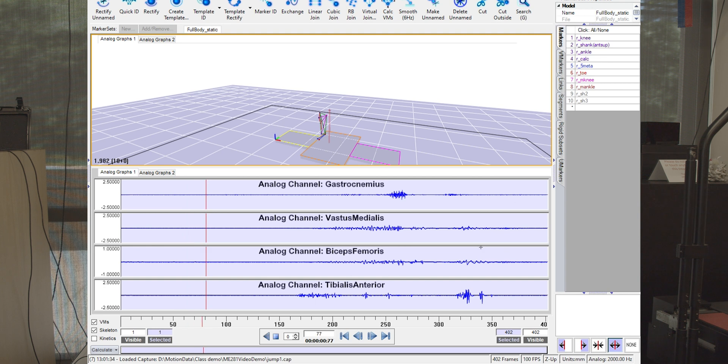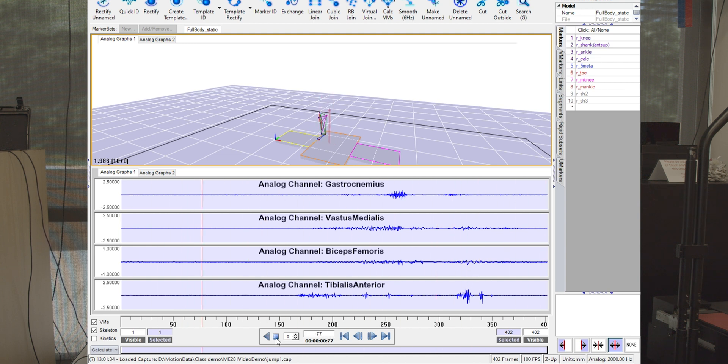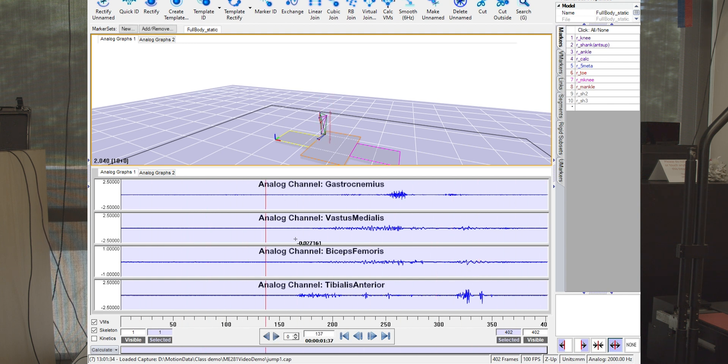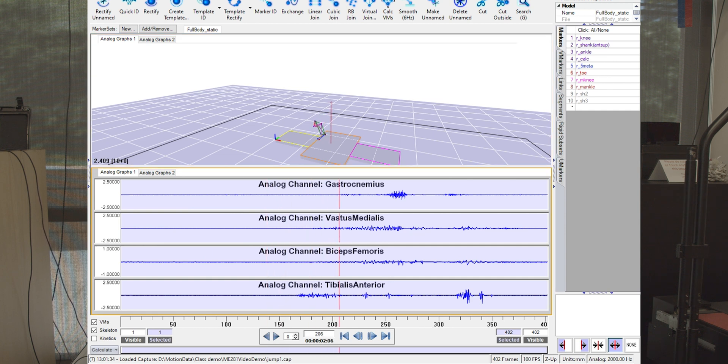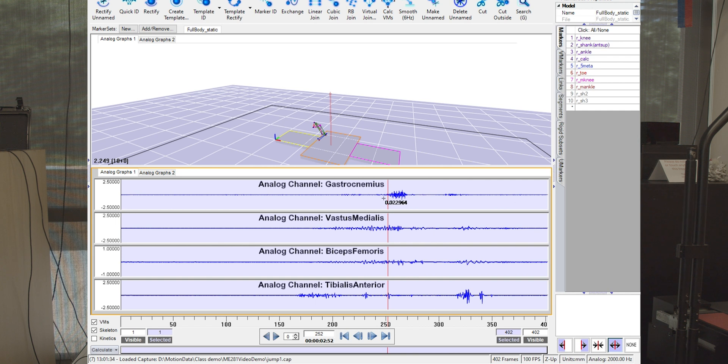So as I'm crouching down, my vastus medialis activates. And then as I'm starting to come back up, my gastroc activates as I'm plantarflexing to leave the ground and take off.